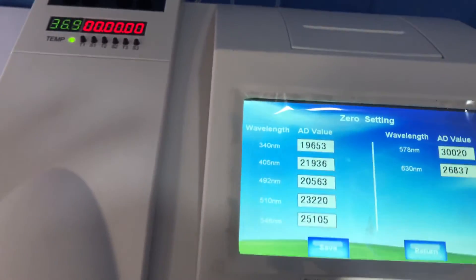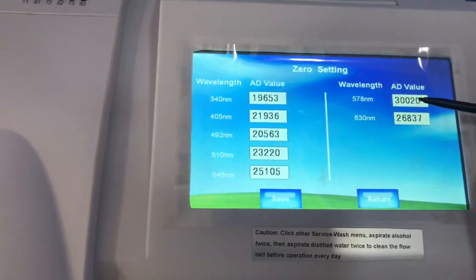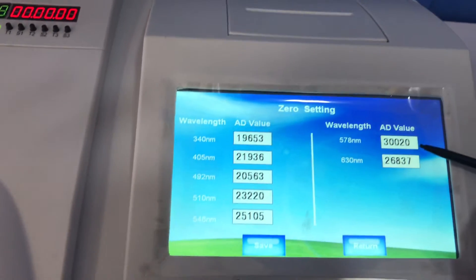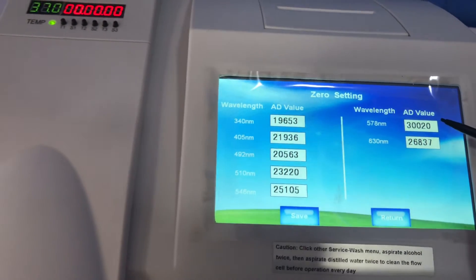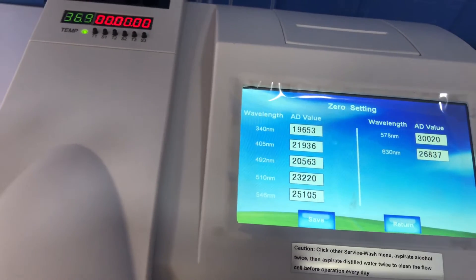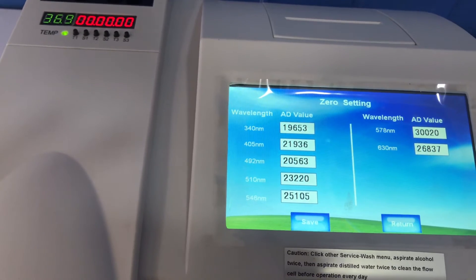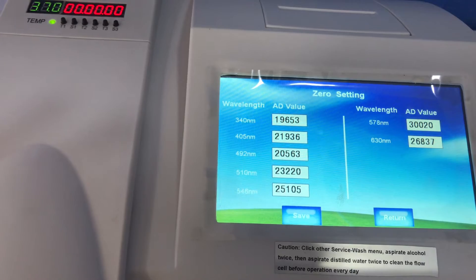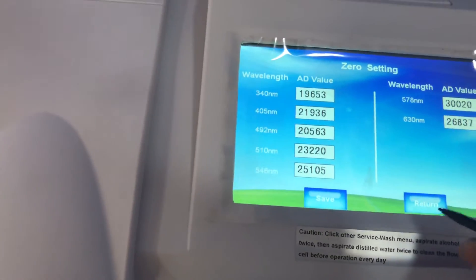The zero setting is done. As you can see, the 578 nanometer wavelength has displayed a value above the normal range, which means there are air bubbles within the flow cell. I'll click Return, go to the Wash section, and aspirate alcohol to clear the air bubbles from the flow cell.